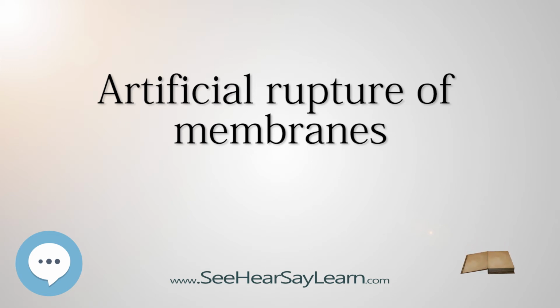4. To avoid having the baby aspirate the contents of the amniotic sac at the moment of birth. Most often, the amniotic sac will break of its own accord, most often by the beginning of the second stage of labor. If it remains intact, it is sure to break with maternal pushing efforts. But in a rare case, the baby can be born with an intact bag that must be quickly broken to allow the baby to breathe.